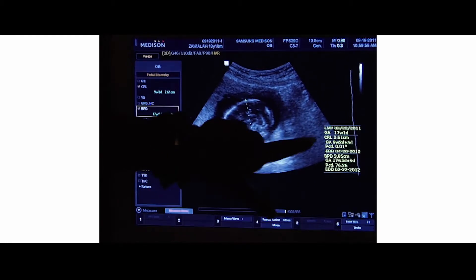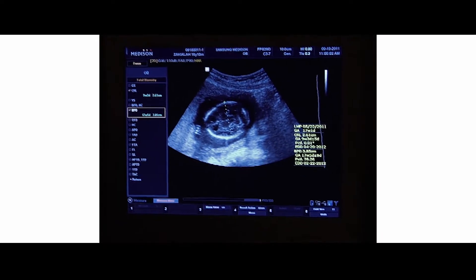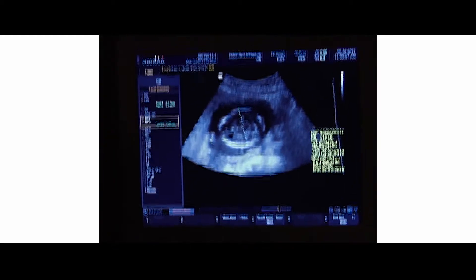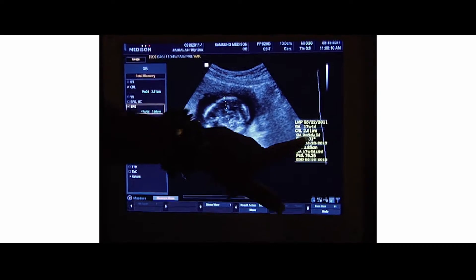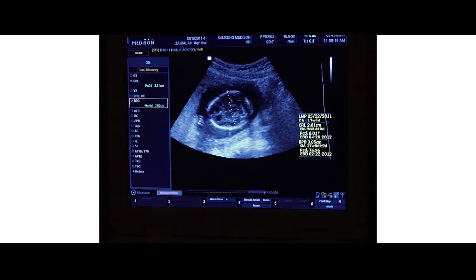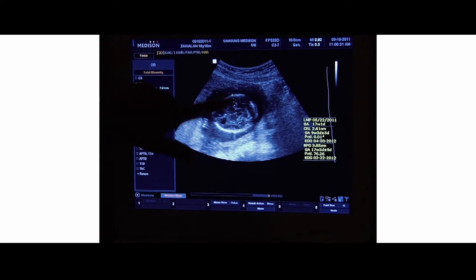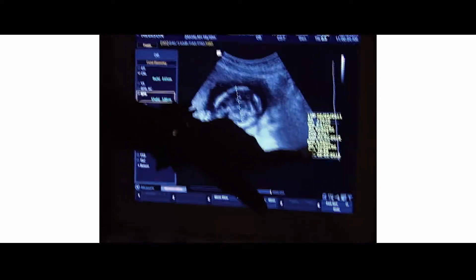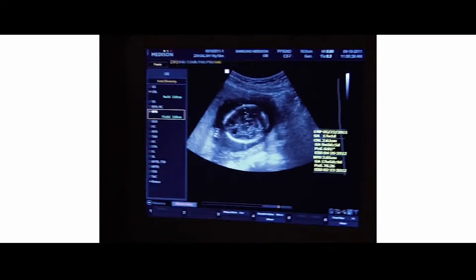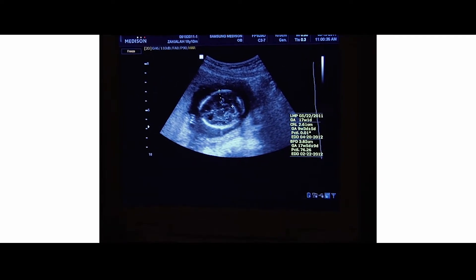To do your head circumference, hit Calc, hit fetal measurements, BPD, and go outer to inner. Watch out — when I was playing with the machine we got a crown-rump length measurement on there and it put her at 9 weeks 3 days. You've got to go to that report and get that out — it's going to mess up all your measurements. Here's her BPD — it's getting her at 17 weeks 5 days and measures 3.85 cm. That's good.